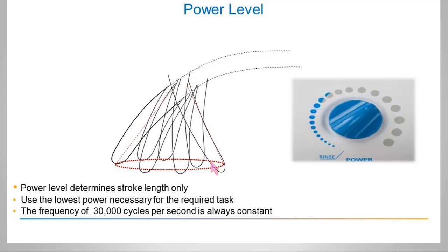It's also important at this point to consider tip wear and efficiency. As our tip wears, not only do we encroach on that nodal point, but we're also affecting the stroke length.